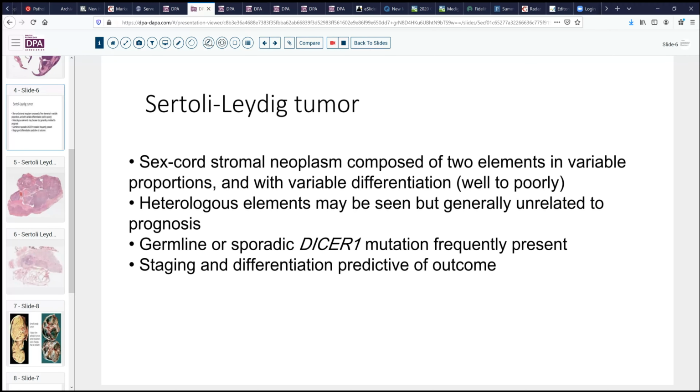It's been said that the well-differentiated tumors, such as the one that we just looked at, have an extraordinarily good prognosis and essentially are benign. And that may be why in this particular patient, the presentation was not discovered until she was in her 6th decade.